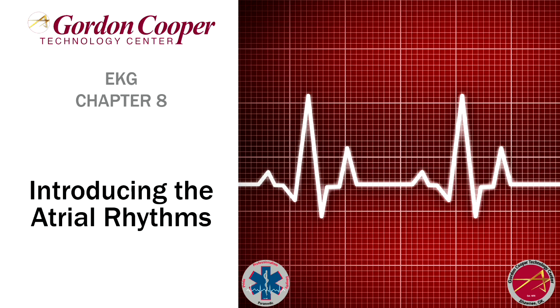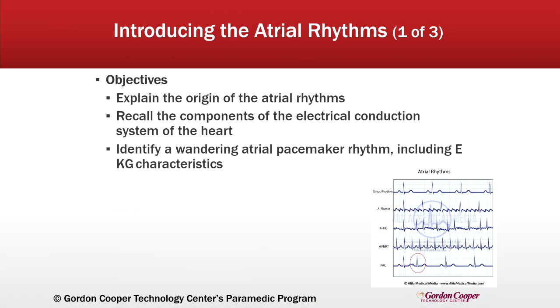All right, here we go. Back on EKG, Chapter 8, Introducing the Atrial Rhythms. Let's see what we're going to talk about. We're going to talk about the origin of atrial rhythms. You know, we're going to talk about the electrical conduction system of the heart.